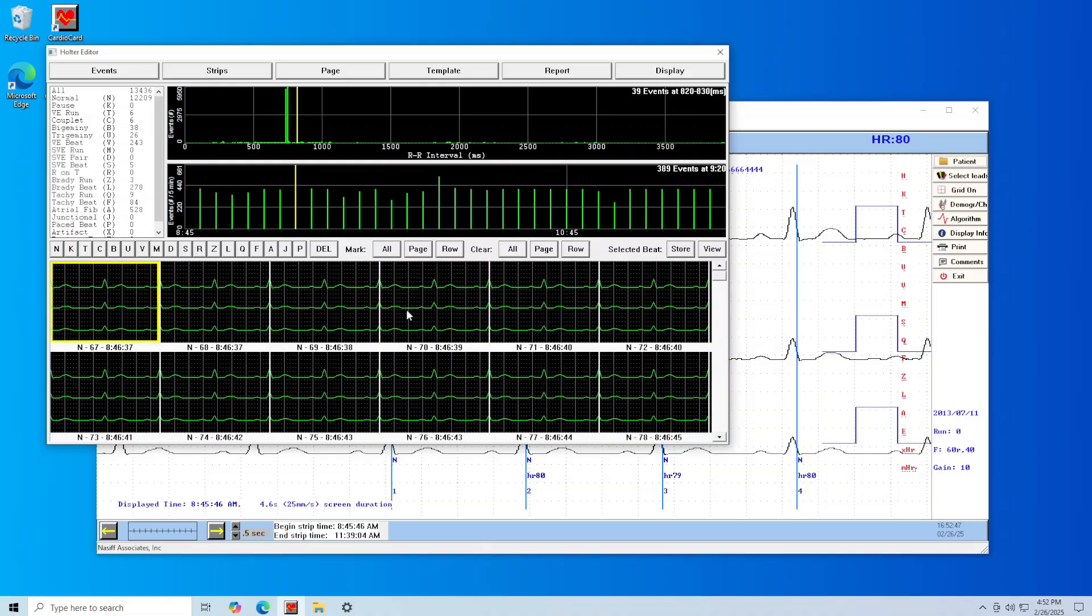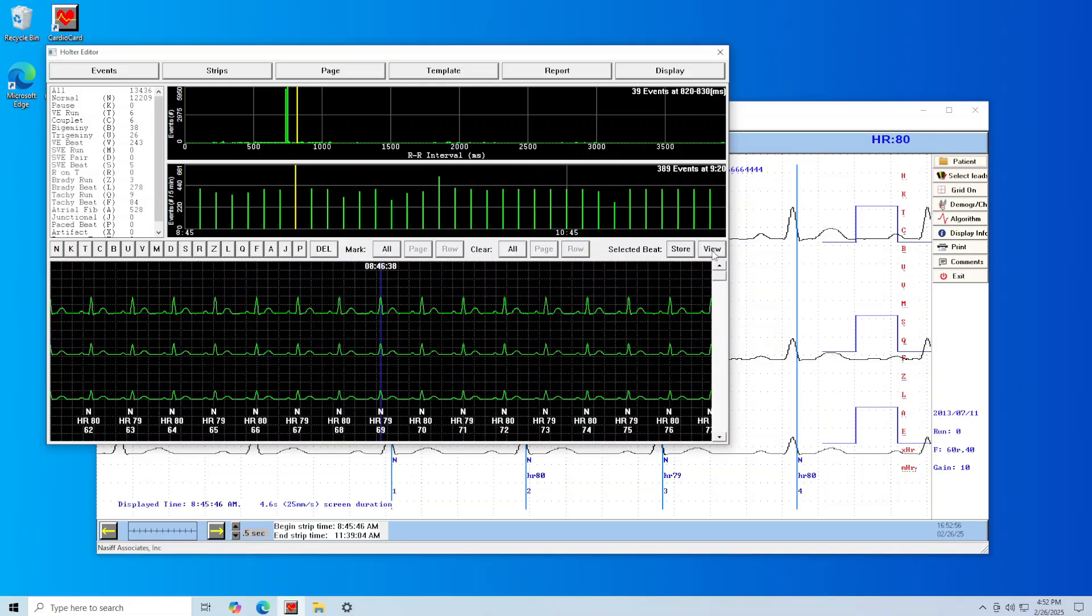To view a section of test, select the section once so it is highlighted in yellow and click on View. This will expand the view of the selected time section of your Holter test. To go back to the condensed view, just click on View again.